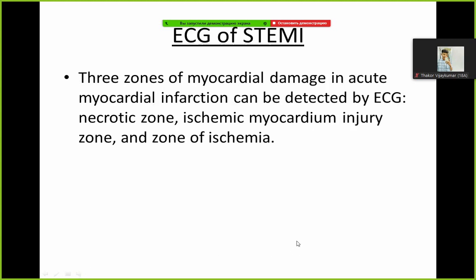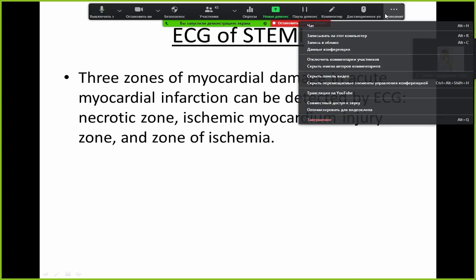Now we will talk about ECG in case of ST segment elevation myocardial infarction, STEMI. In case of STEMI, we have three zones which may be detected by ECG: the necrotic zone, the ischemic zone, and the zone of ischemic myocardial injury.